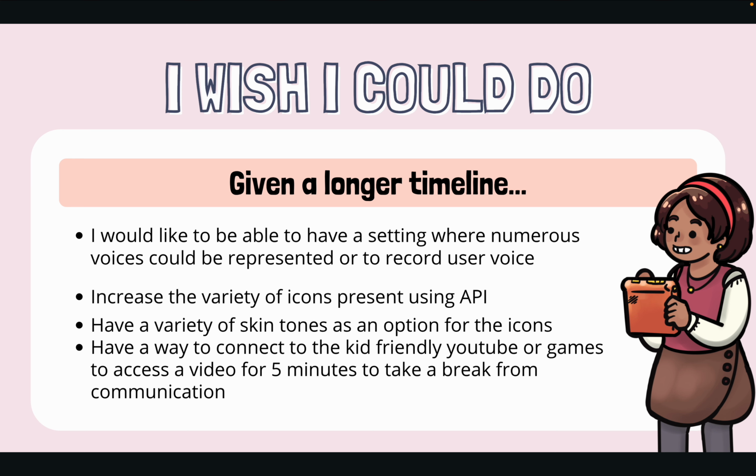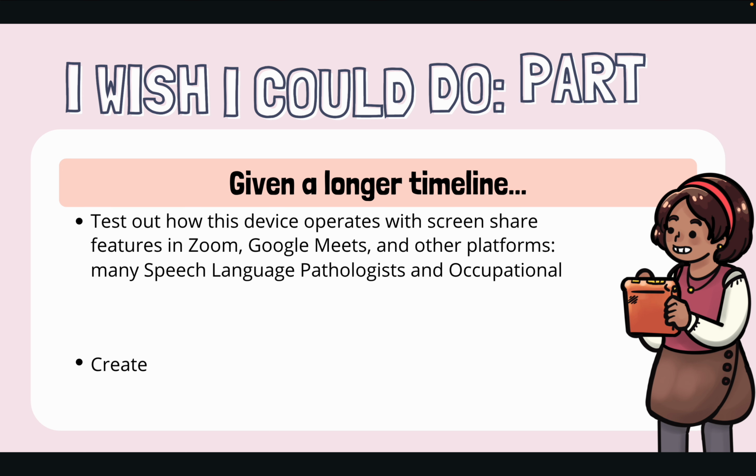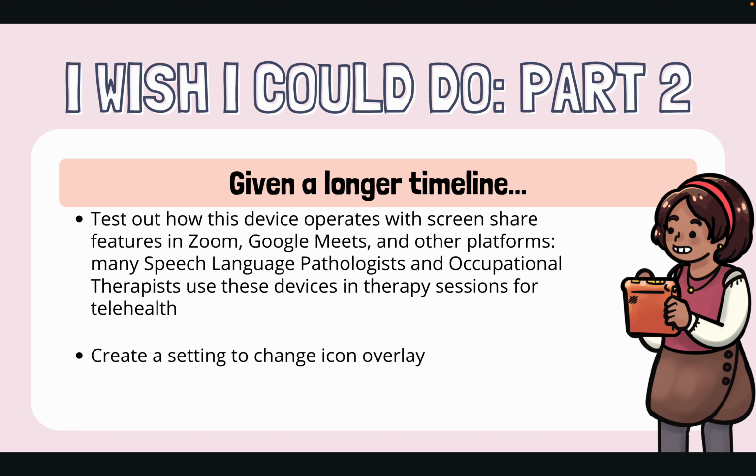Have a way to connect to a kid-friendly YouTube or game for the child to have time from talking, because sometimes it can be overwhelming or time-consuming or just tiresome for a child to constantly point to that symbol to communicate. I would also like to look at features of accessing the device in Zoom or Google Meet, as many speech language pathologists and occupational therapists would use a device in order to communicate with their patients who are nonverbal.